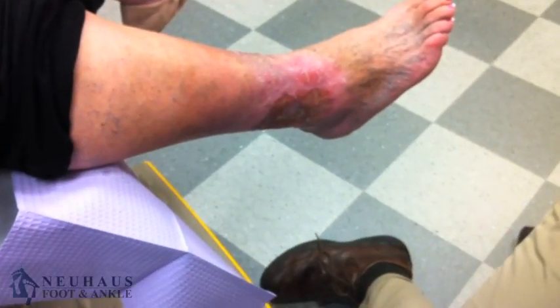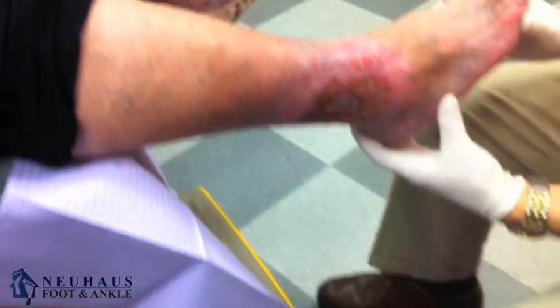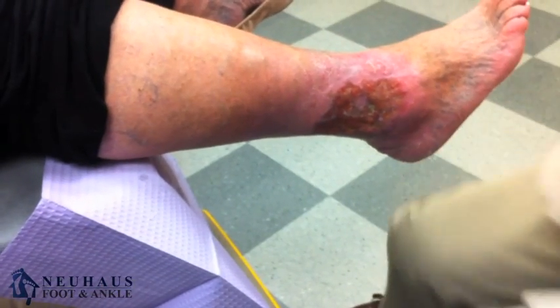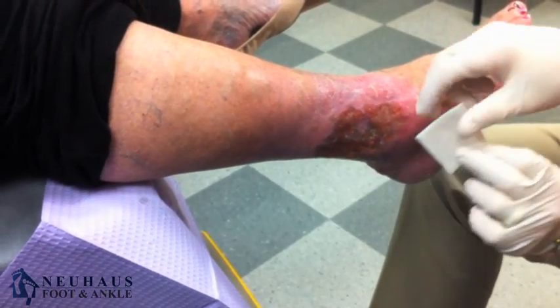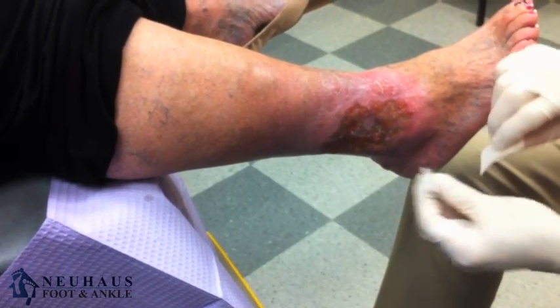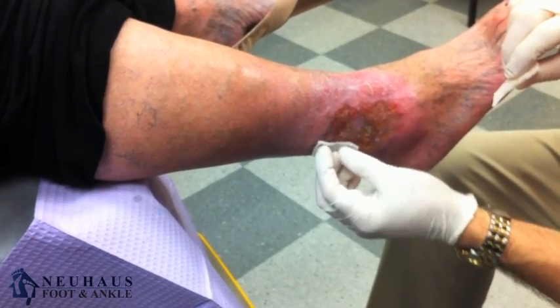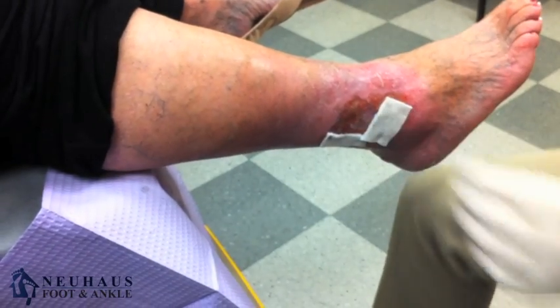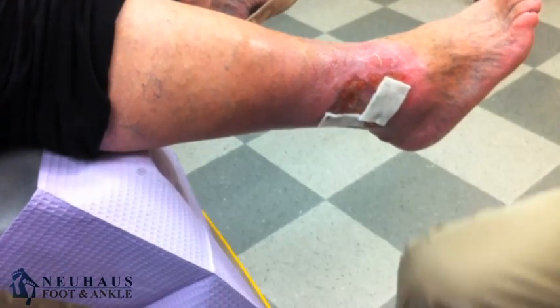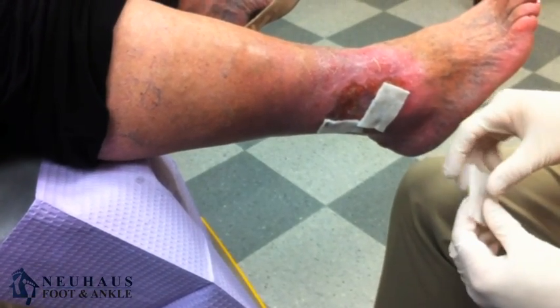Hey, this is Dr. Newhouse. I've got another video for you. This is a patient who has what we call a venous stasis ulceration — a wound that's due to poor circulation, actually with the veins. In this situation, a lady came from another country and has this wound, has had it for several years, had treatment there which was just basic wound care, putting creams and such on it.